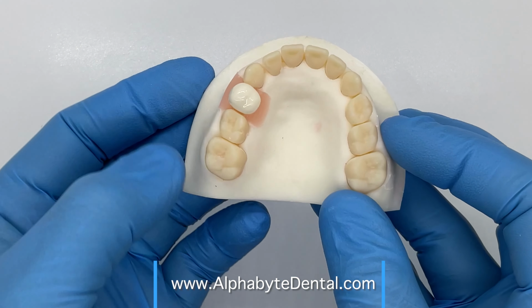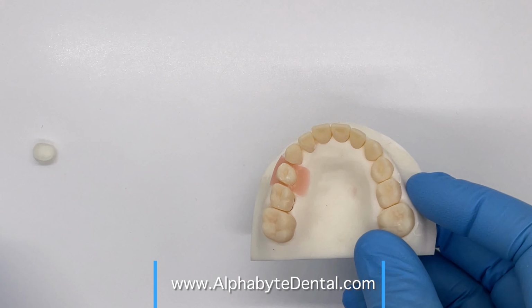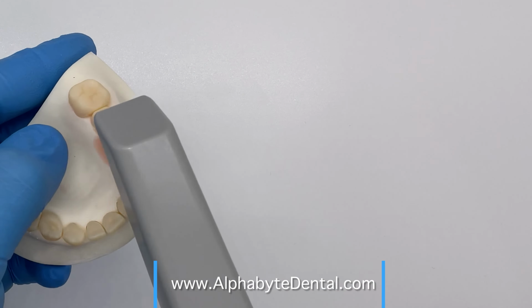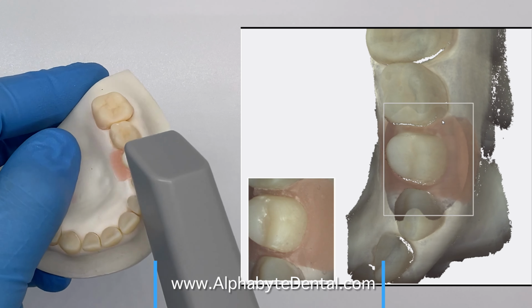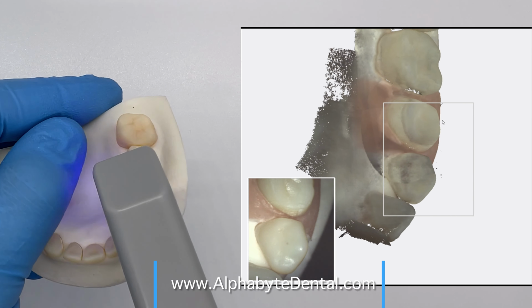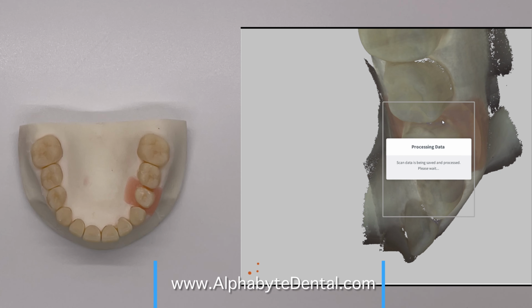No longer is that the case, because simply by using the scanner, passing it over your initial preparation attempt, and rerunning the automated algorithm that analyzed the preparation form, in mere seconds we can pre-answer those gut-level questions that were ordinarily blindly refining this tooth circumferentially.